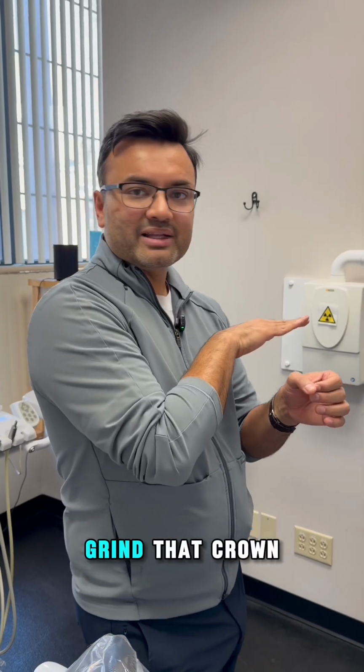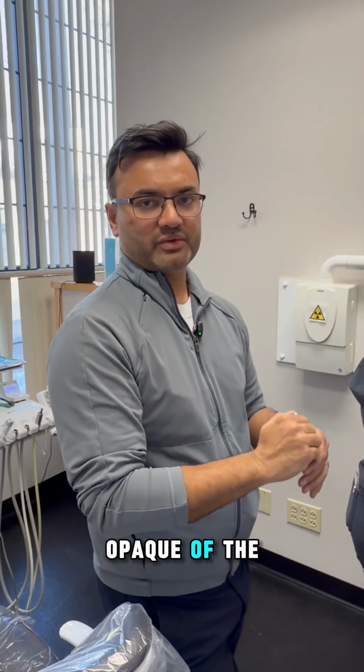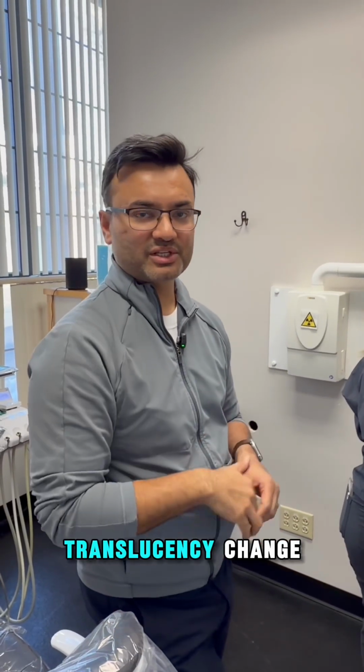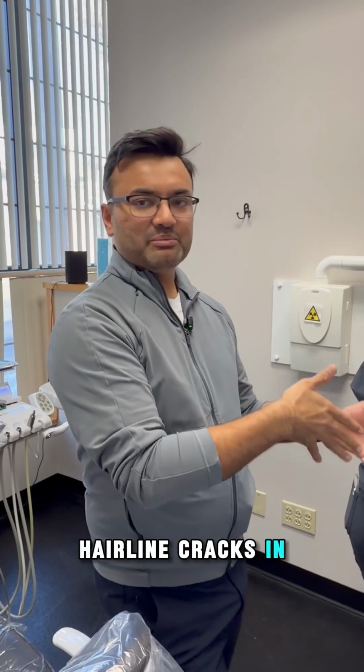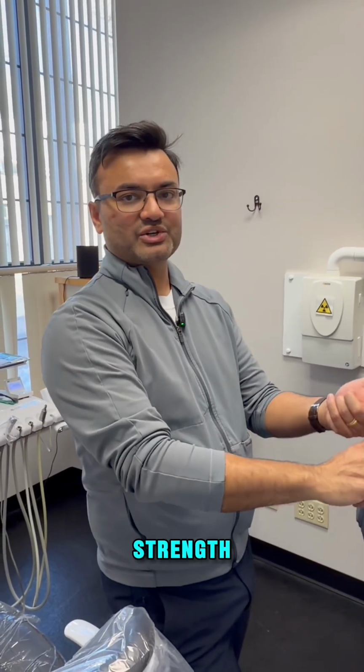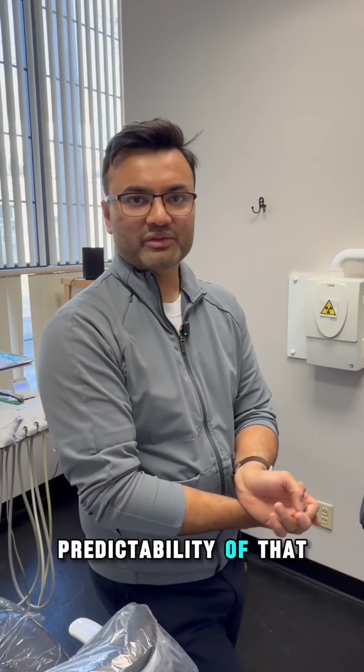The moment you grind that crown down by half a millimeter, only the white opaque of the zirconia is going to show. So now immediately the color change, translucency change. Hairline cracks in porcelain are starting to happen. So the more you grind, you are losing the strength, you're losing the predictability of that crown.